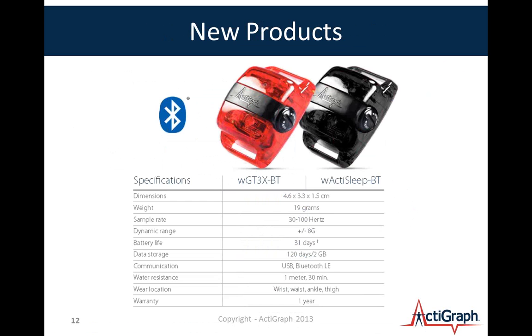Okay. There are a lot of good questions that I just haven't covered. There was one in the area of feature extraction. In raw data format, which frequency is recommended to be used between 30 and 100 hertz? Now, Jeremy, I know typically we don't consider ourselves really the researchers here, so I don't really think we can give a recommendation of which frequency to use for a use case.